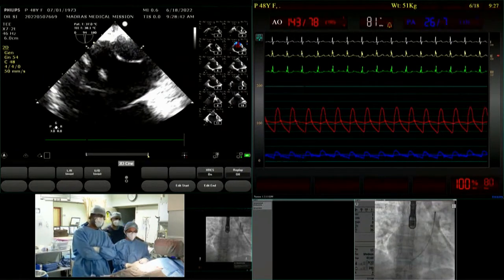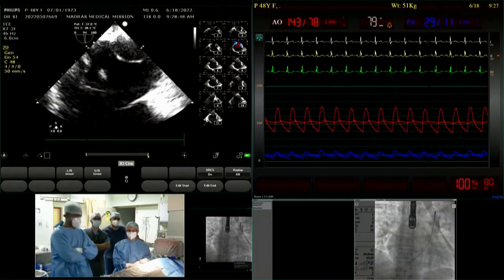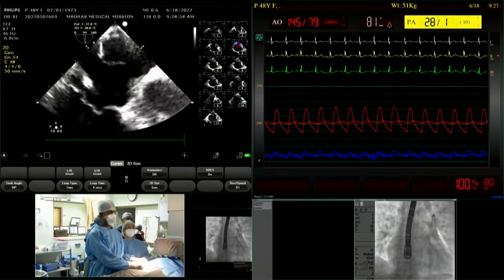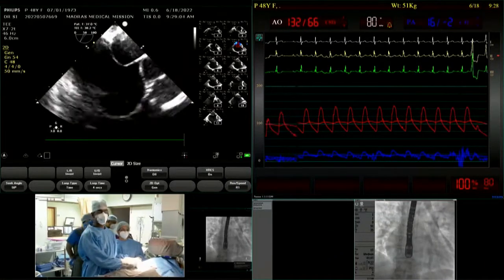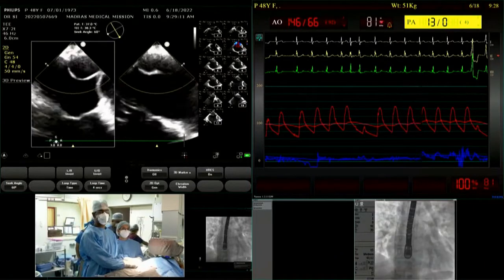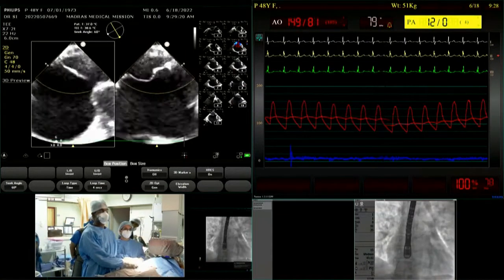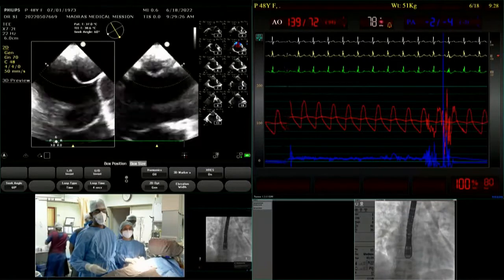Let us take one or two points from the floor and other moderators before you go ahead. What is your plan? You may have a very quick picture of 3D, no? Do you have that? Why I ask 3D? Several times with 2D, sometimes you think that one device is sufficient or the devices overlap. 3D will show you the area actually, especially in multiple ASDs. For a single ASD, I don't think it is going to be useful. Multiple ASDs. Do you have any question, Bhavish, Rita? Any questions from the floor? So there are no questions. You can go ahead with your plan.